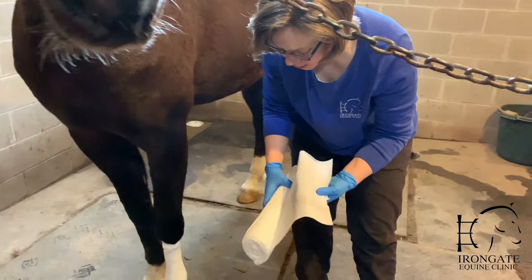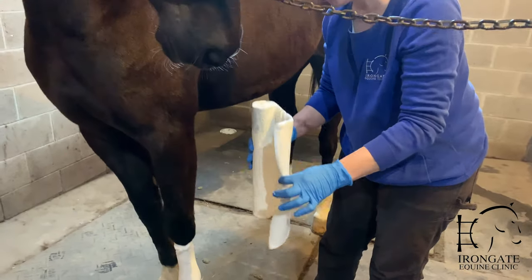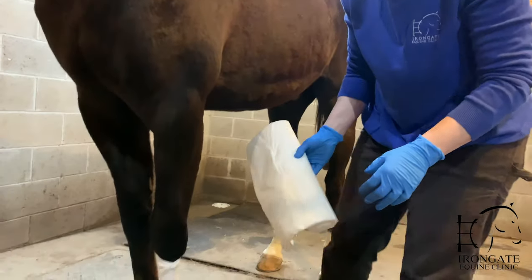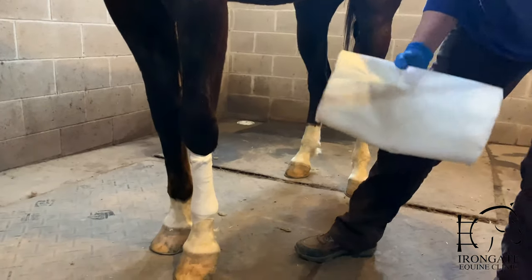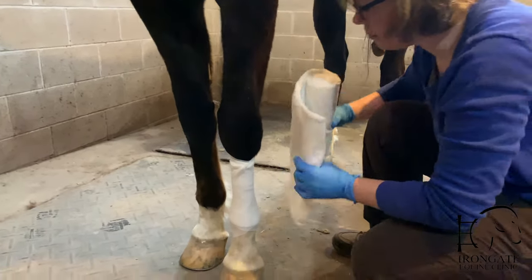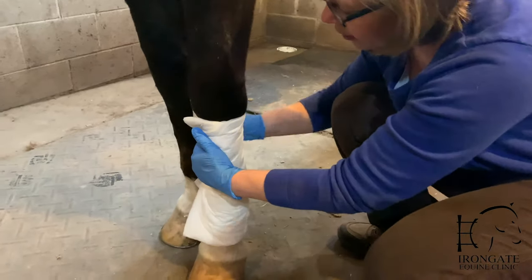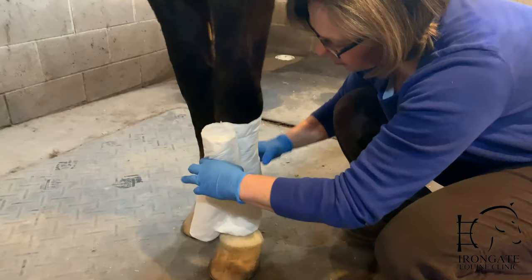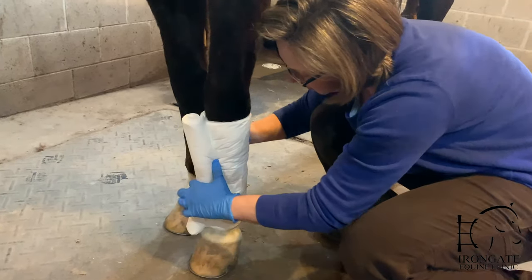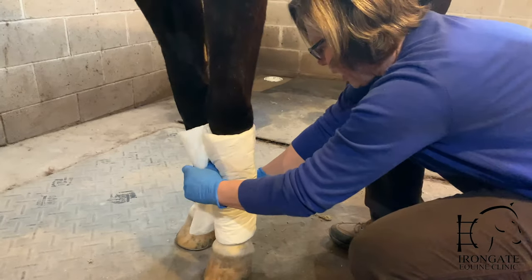This is a front leg, so in a horse this size, we usually use a 14-inch cotton roll because that will fit nicely between the knee and the ankle. And then I like to hold it in place with brown gauze. Just lay it gently on the leg and roll it on, keeping it snug but not overly tight — you want it to stay in place, but not cut off circulation.